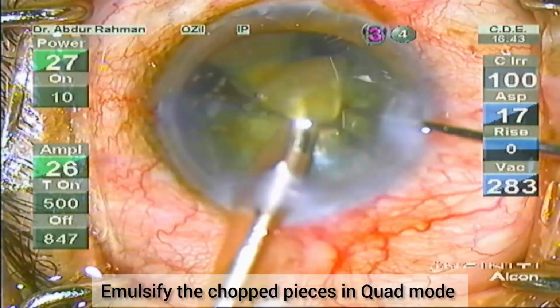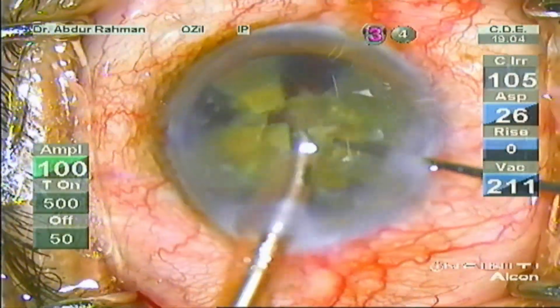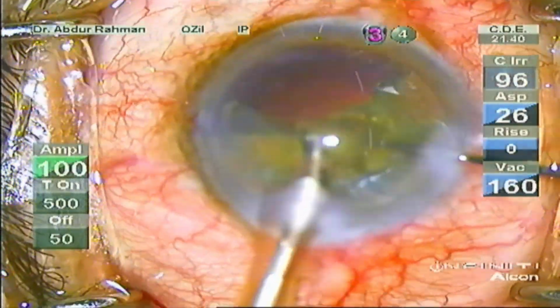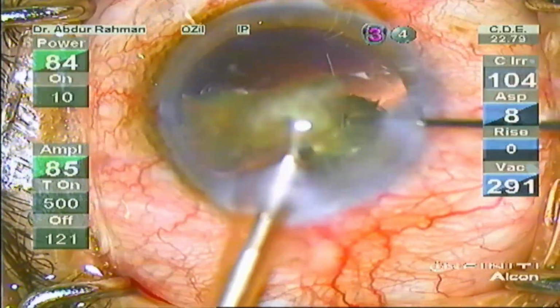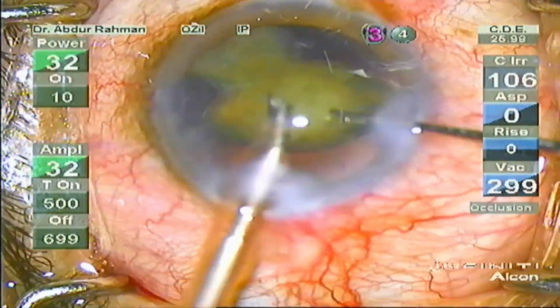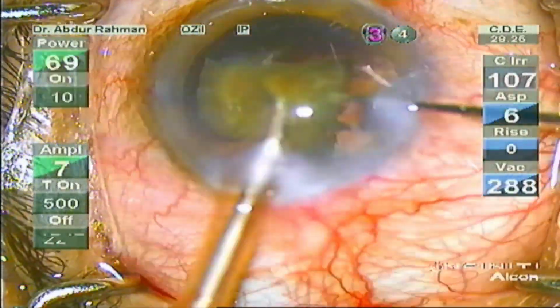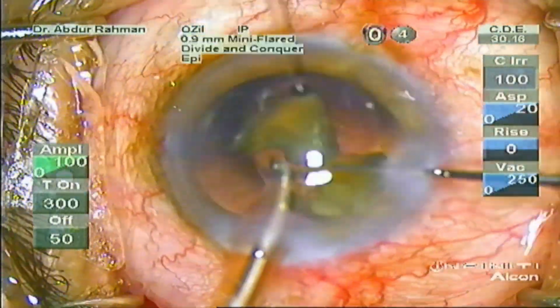Now emulsify the chopped pieces in quadrant mode at the pupillary plane, that is at the iris plane. So it is sufficiently away from the endothelium of the cornea and there will be less chance of endothelial loss during phacoemulsification. Now slowly eat all the pieces.